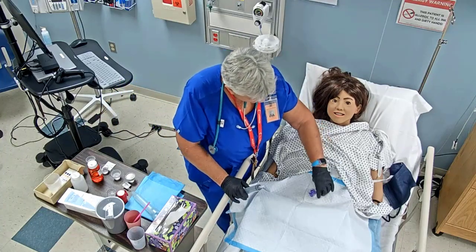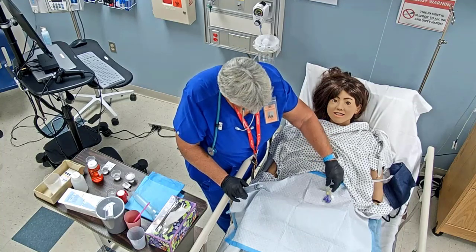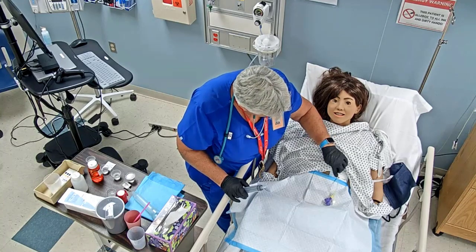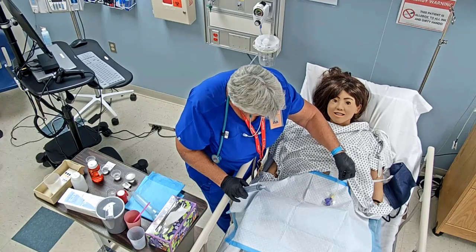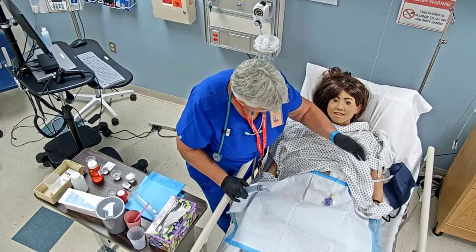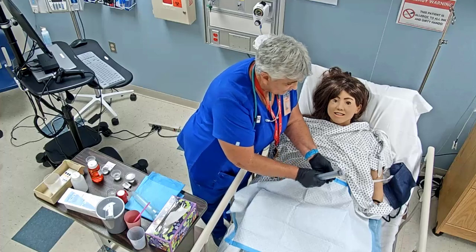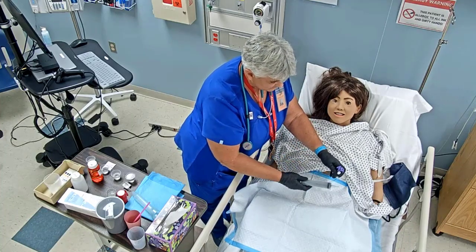On the PEG tube, we need to make sure that it's not clogged to begin with. And then we're also going to be checking the marker at the skin level as well, okay, to make sure that the marker is there. If it's come out or you can't see it, then we would need to stop, okay? That would be unexpected. So the expected, we're going to look at that marker right there. Okay, so with this, if you can clamp it, you clamp it, but these don't clamp.